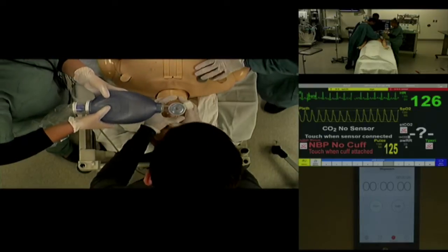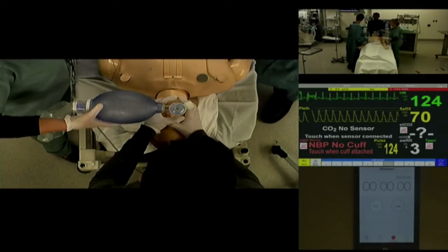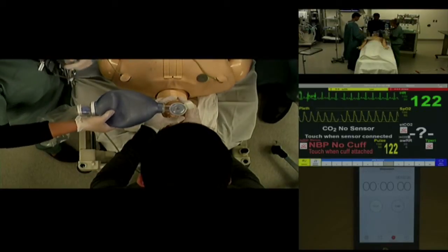Saturation is now 74%. There's no chest rise. This is a can't intubate, can't oxygenate situation. Let's move to crike.